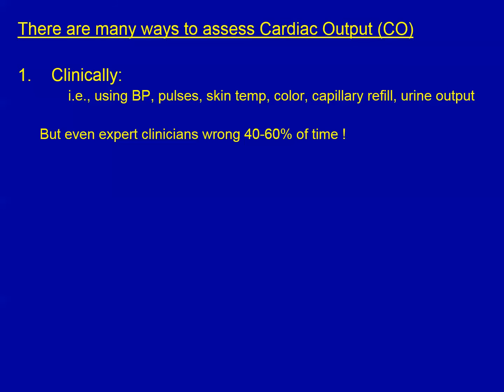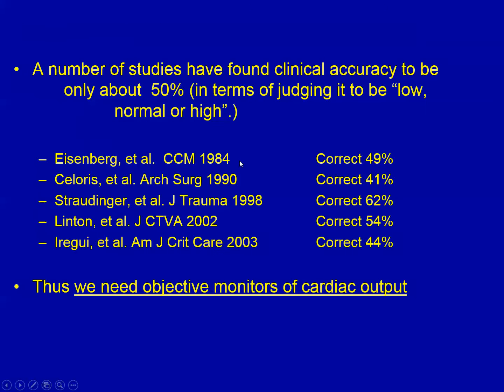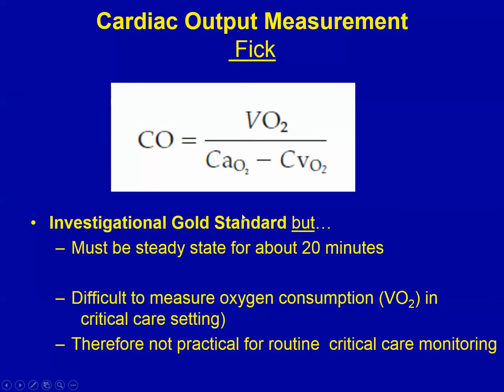We usually do it clinically, but unfortunately even expert clinicians are wrong about 40 to 60% of the time, as summarized in these 5 studies. Thus, we need objective monitoring of cardiac output.